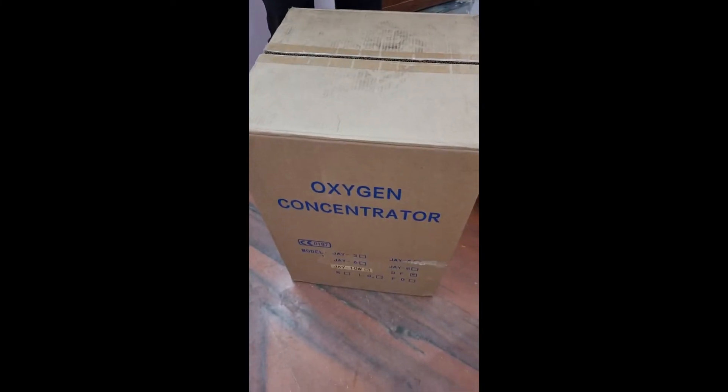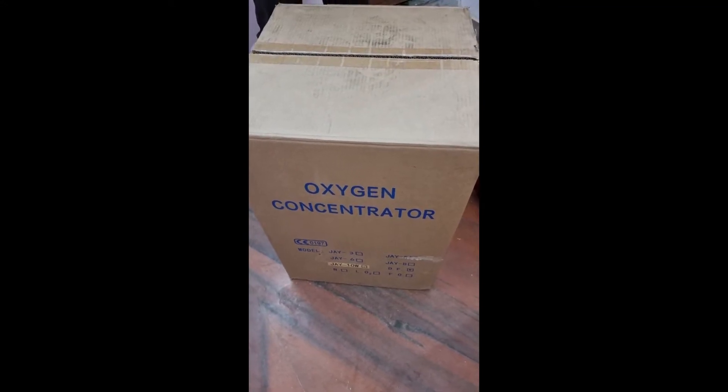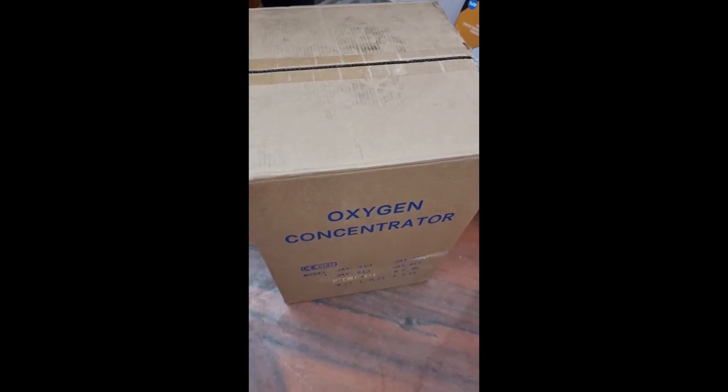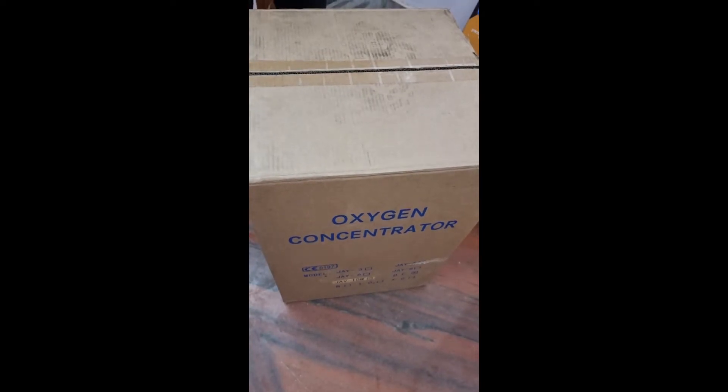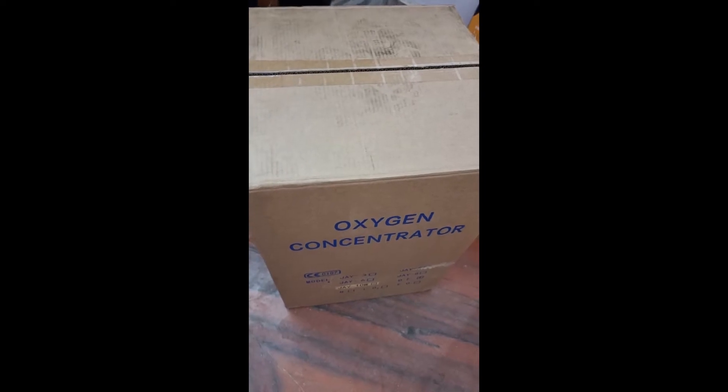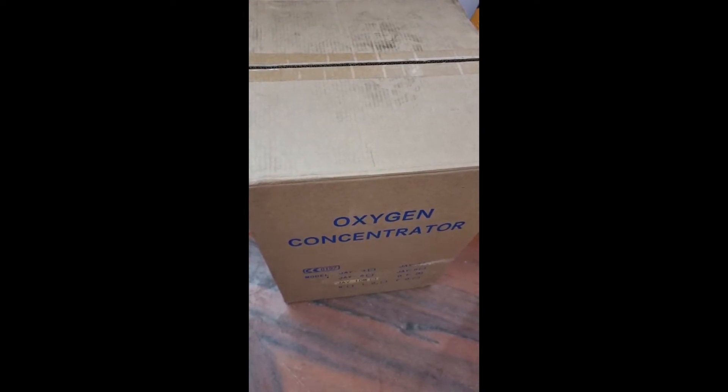Hi, welcome to Entrusted Medical Devices. Today we are going to see the unpacking and installation of the Entrusted OxiCare Prime A, Model Dual Flow 10 LPM Oxygen Concentrator. This is a medical grade oxygen concentrator, so we will be showing you the unpacking and installation of the entire product.